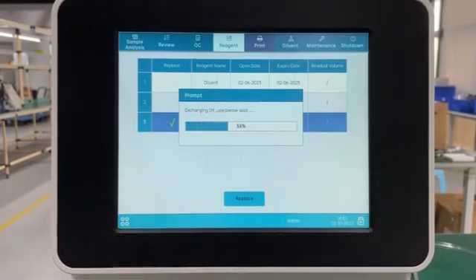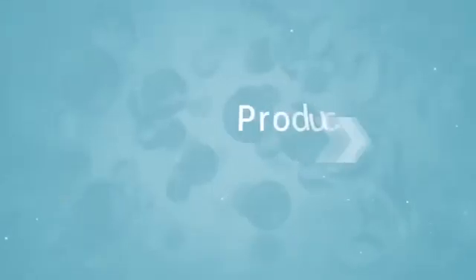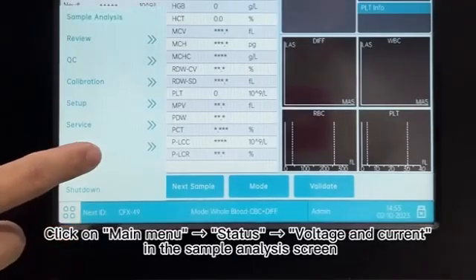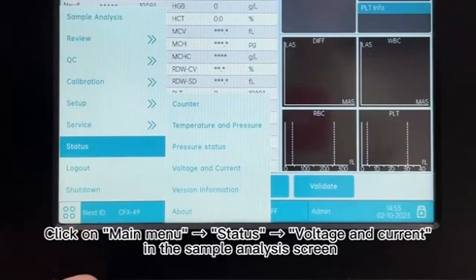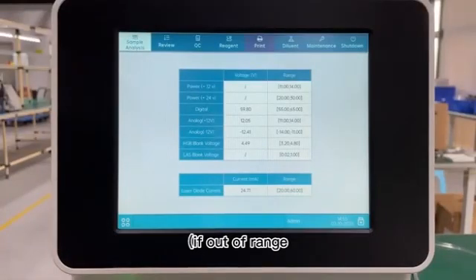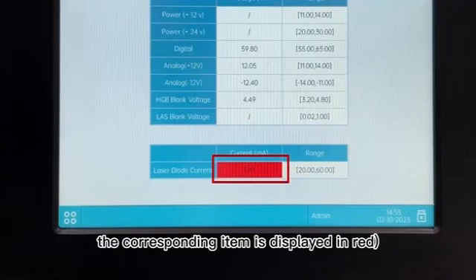19. Product Status Confirmation. 20. Click on Main Menu, Status, Voltage and Current in the Sample Analysis screen. Check whether the measured voltage is within the range. 21. If out of range, the corresponding item is displayed in red.